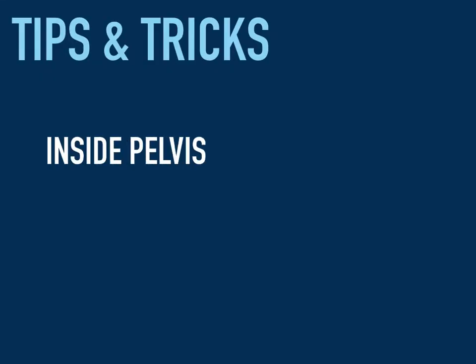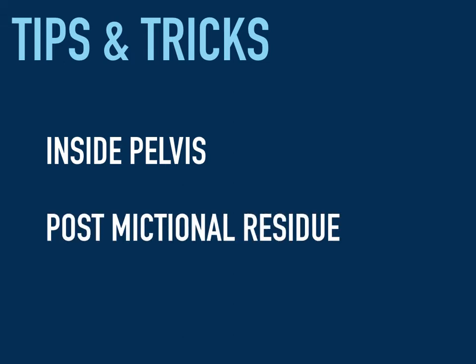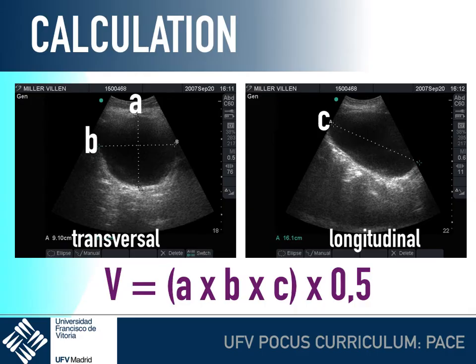Tips and tricks. Remember that the bladder is inside the pelvis. And remember to measure the post-mictional residue. For evaluating what is inside the bladder, the calculation, you have this way to do it.